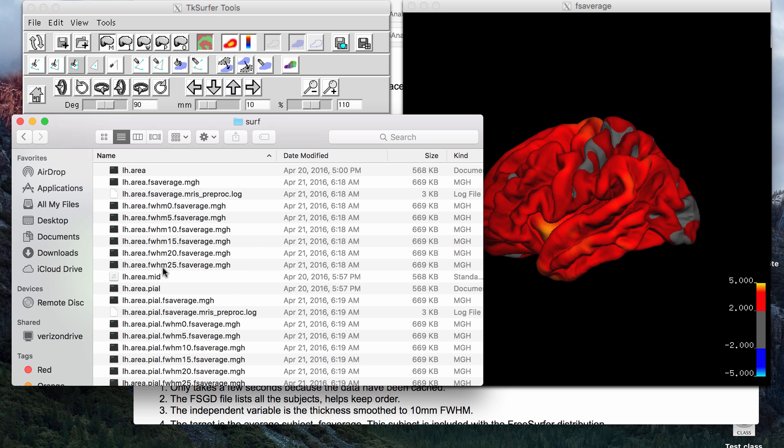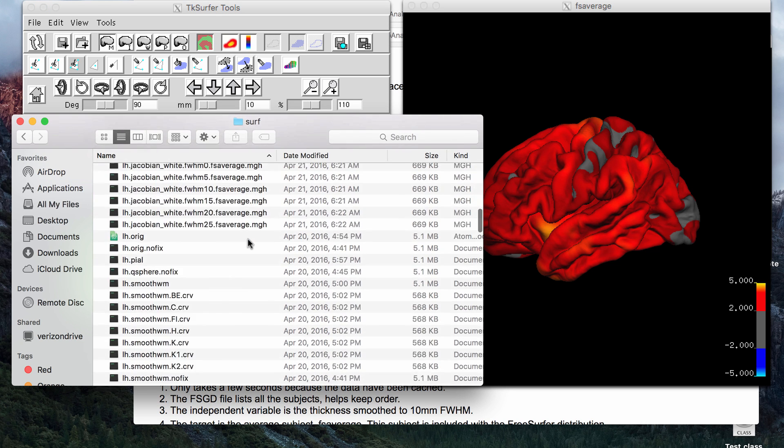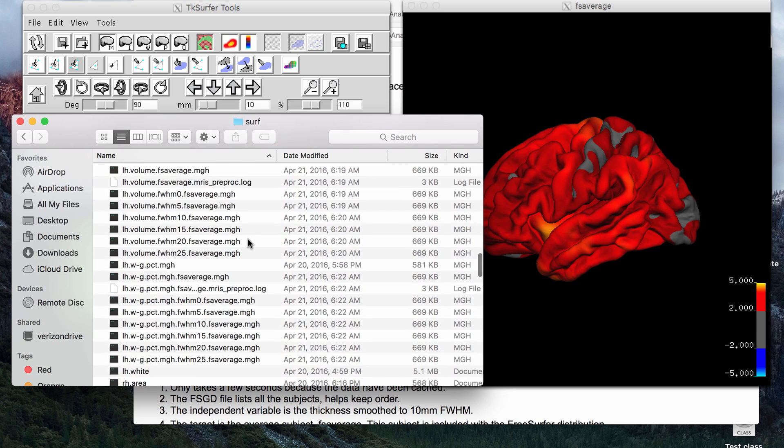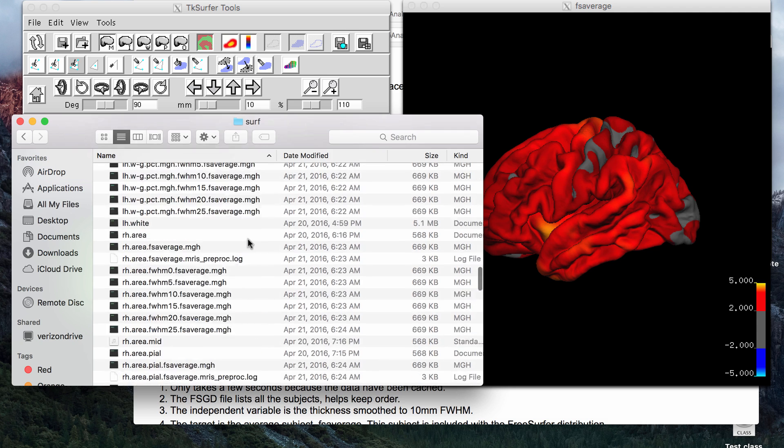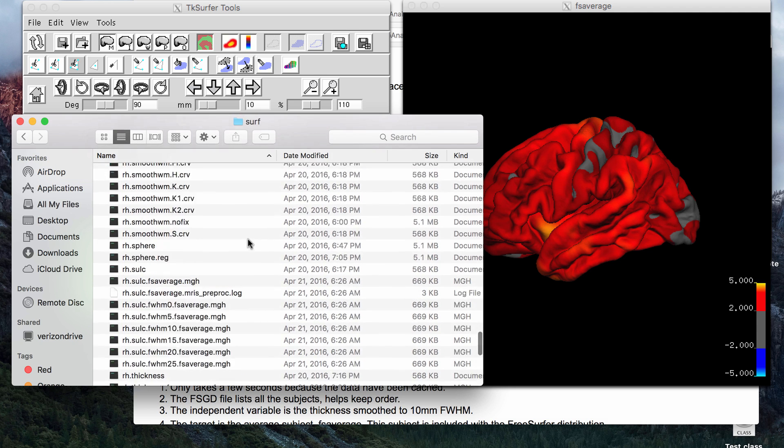You can also, as you see, do area, sulci, volume, apparently, and things like that. Alright, that's the video.